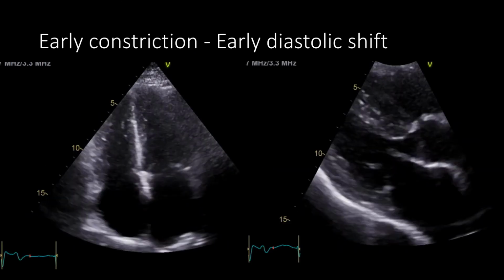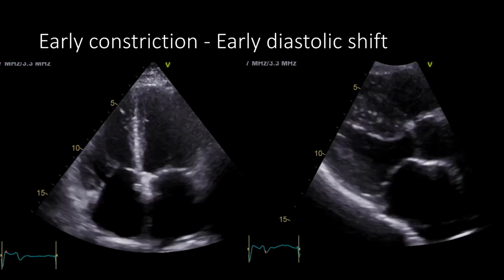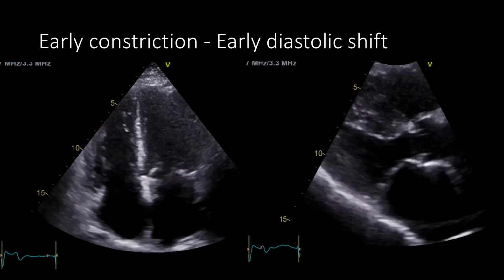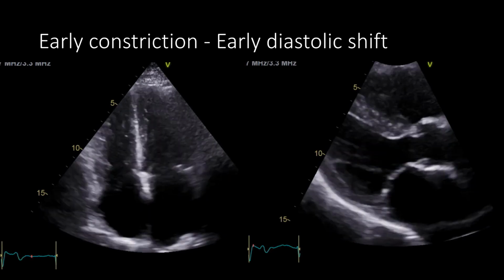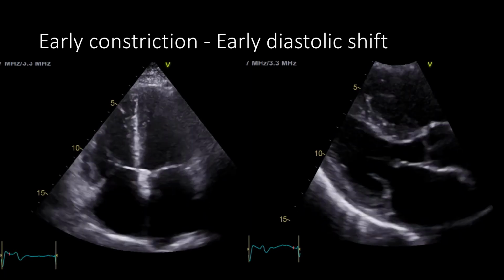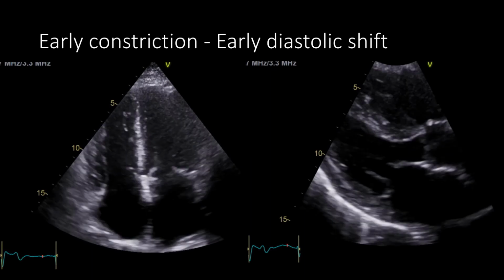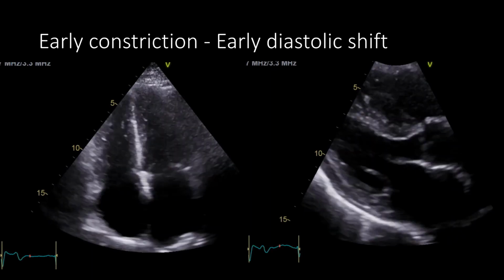Constrictive pericarditis is what most echocardiographers call the bane of the echo consult. It usually is incredibly difficult to identify as the changes can be quite subtle. The telltale mark is a subtle septal shift. This series of images was a suspected constriction that remains unproven, but highlights this subtle septal shudder that you may notice.